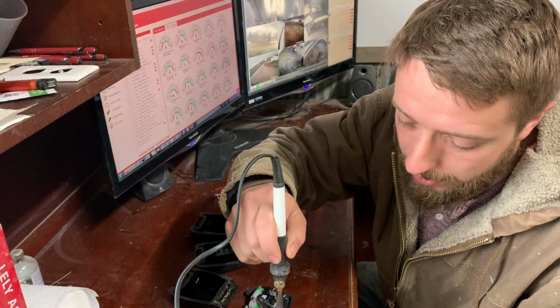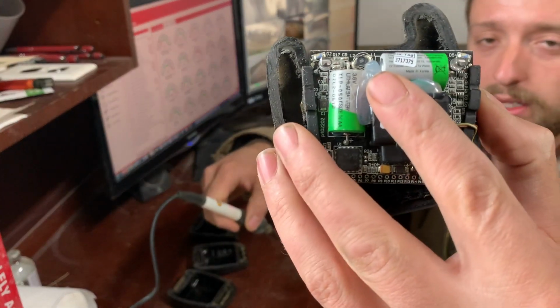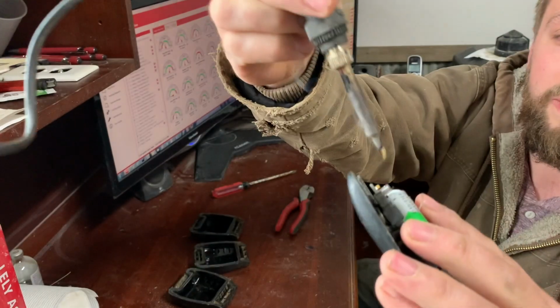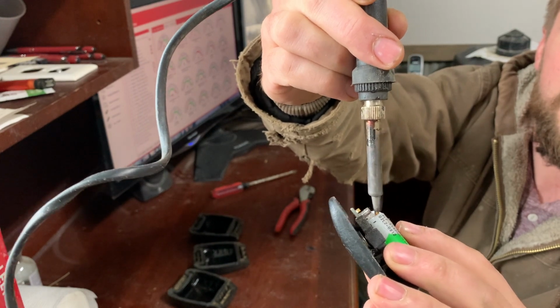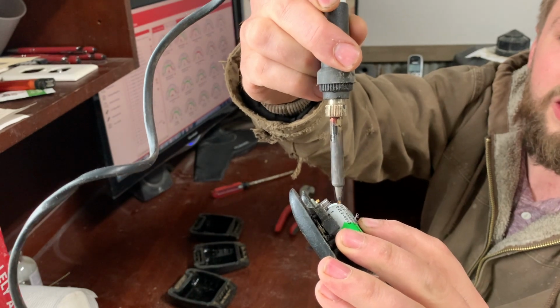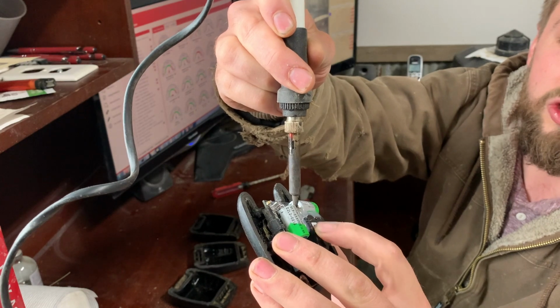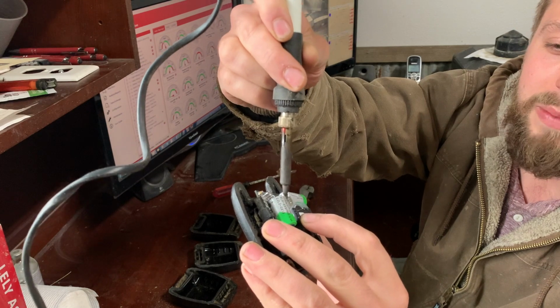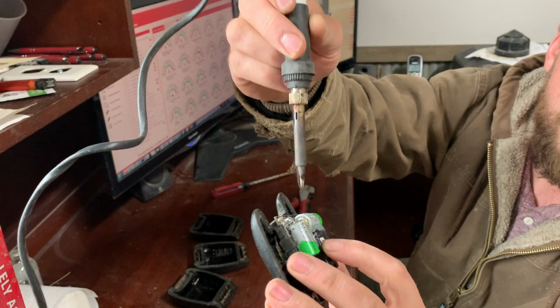On some of them, especially this one right here, we have some caulk that comes over to, I don't know what that thing's called, a capacitor of some sort. I make sure I heat that glue up now and not later, because sometimes when you go to clip that wire in there, that caulk will break that capacitor. I've broken those capacitors, and I'm not sure what they do. These collars have worked without them, but of course it's better to have everything functioning in there. So if you do happen to break that, the collar will still work.